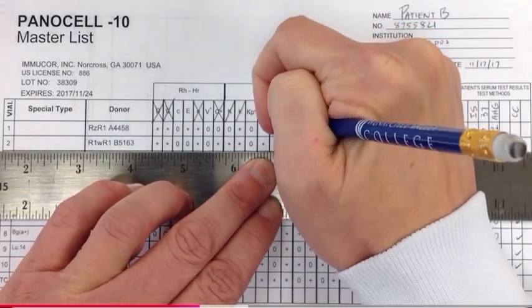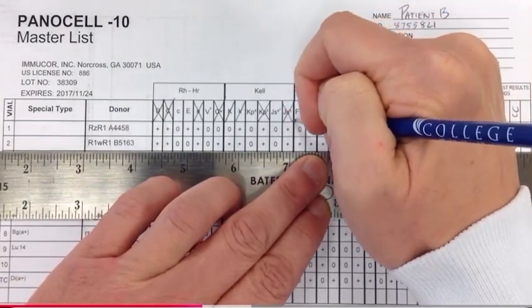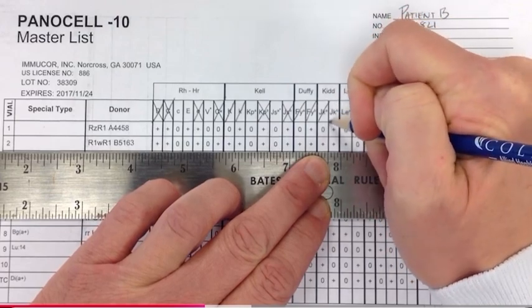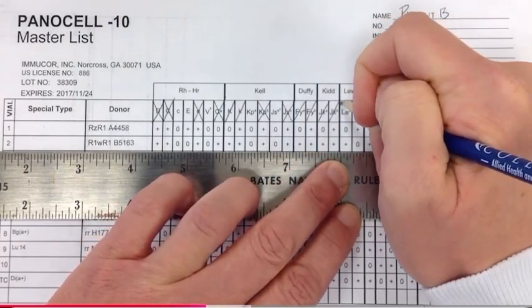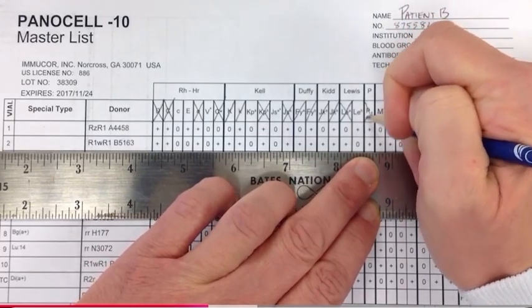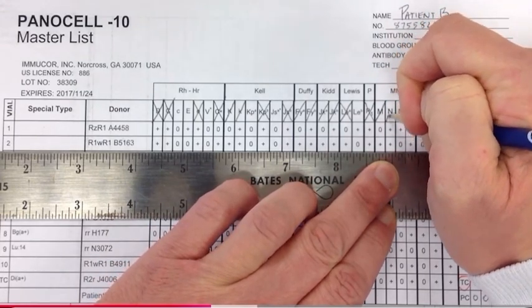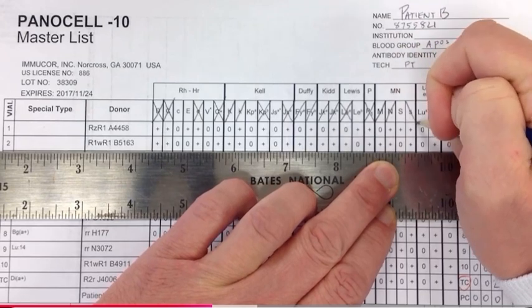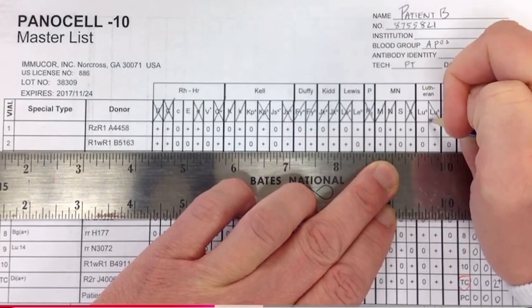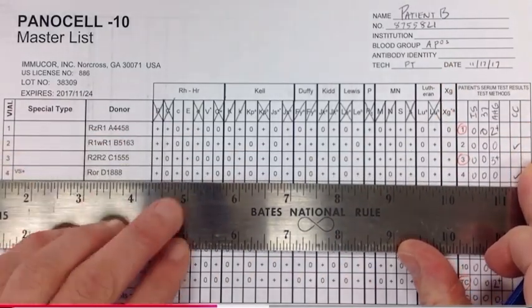Okay, KPB, homozygous. JSB, homozygous. Duffy A, heterozygous. Duffy B, heterozygous. Kid A, heterozygous. Kid B, heterozygous. Lewis A, homozygous, so it gets an X or a cross. P1, we're going to completely rule that out. M, heterozygous. N, heterozygous. Small s, homozygous, so it's going to be completely eliminated. Lutheran B, homozygous, completely eliminated. All right, let's go down to number 4.